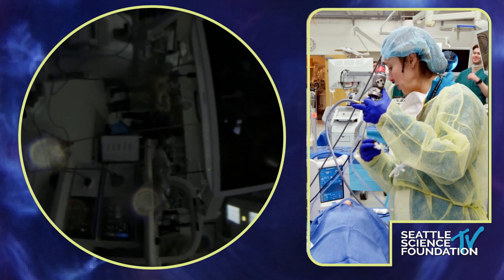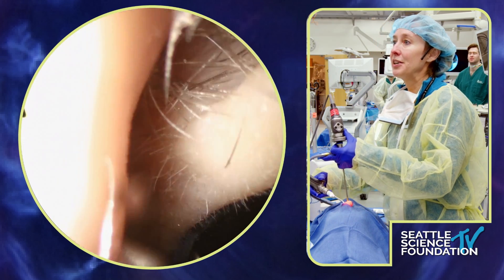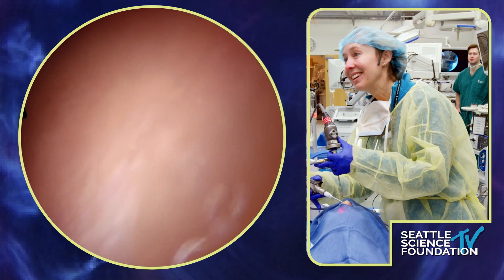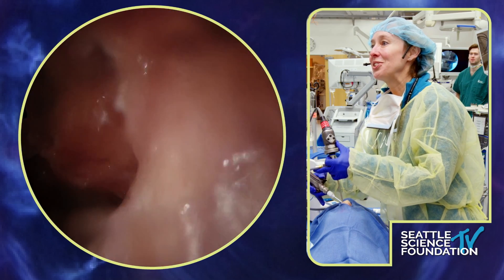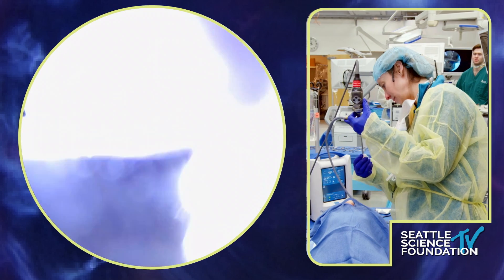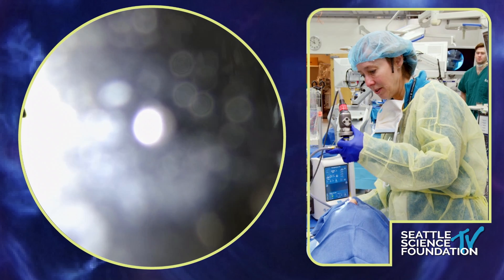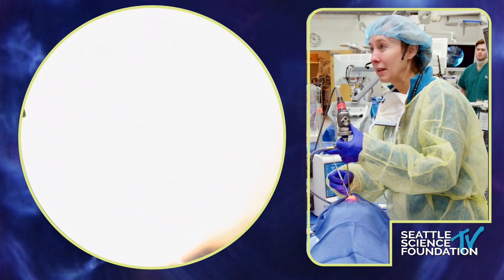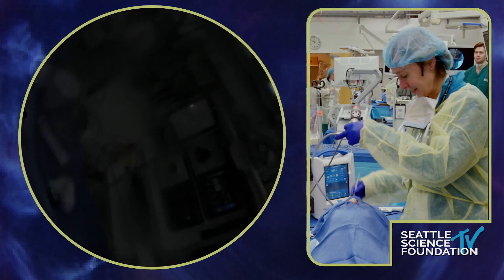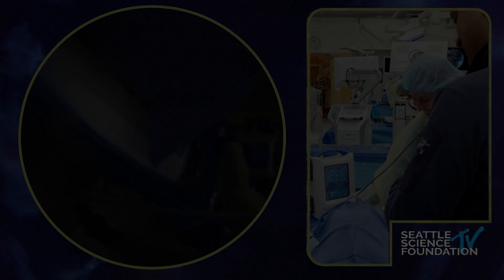Now I've switched to a curved microdebrider and I'm using the 70-degree scope to see further into the sinus interior. That completes the maxillary antrostomy / medial maxillectomy demonstration.